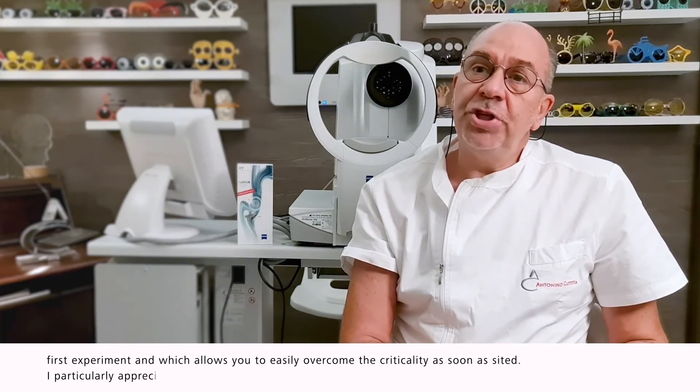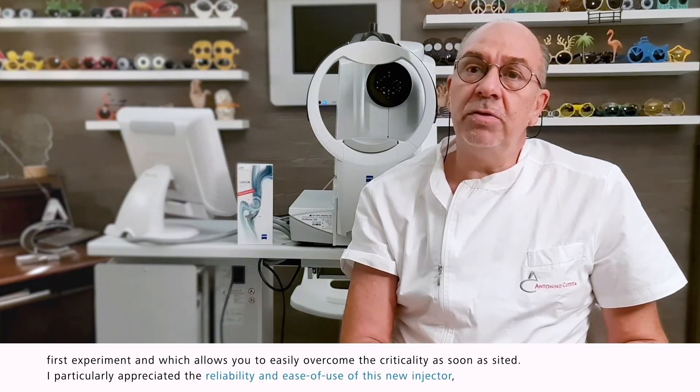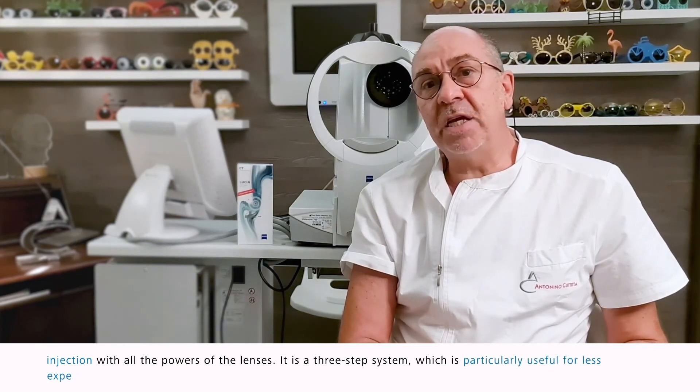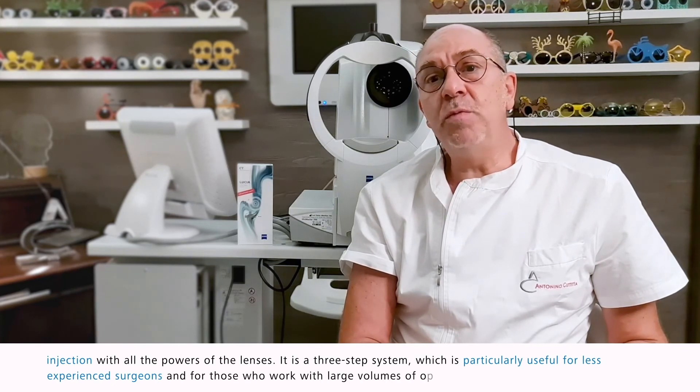I particularly appreciated the reliability and ease of use of this new injector, and therefore the reproducibility of the injection with all the powers of the lenses. It is a three-step system which is particularly useful for less experienced surgeons and for those who work with large volumes of operations.